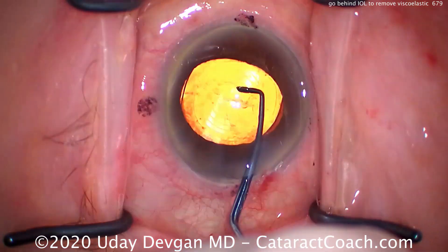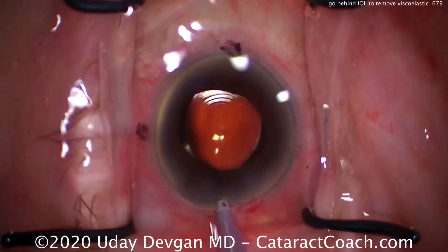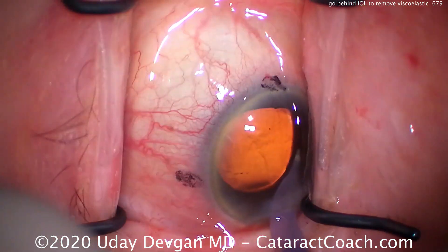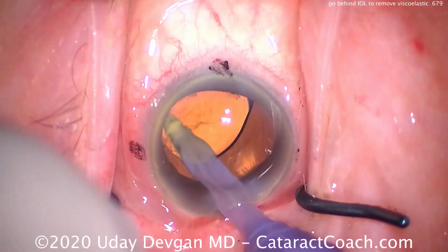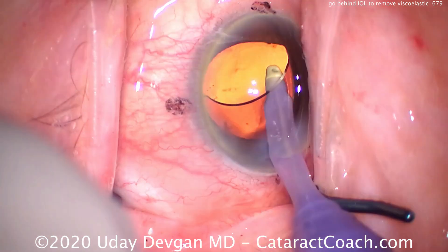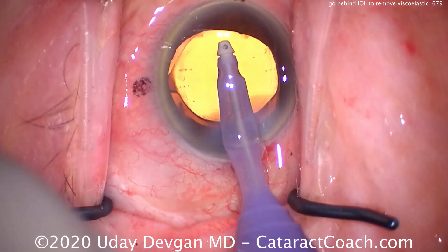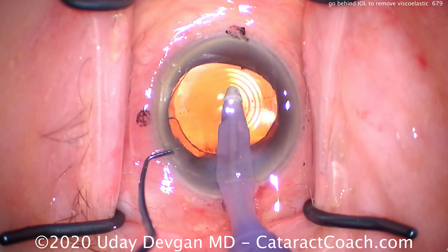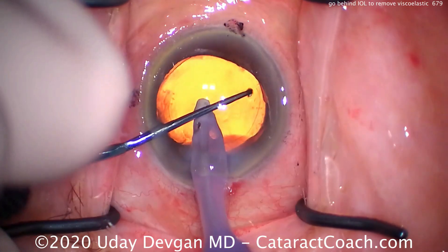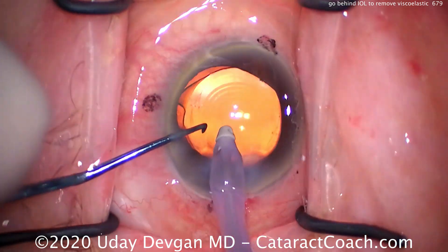Look at this case. You see the toric IOL marks at the haptic-optic junction — so this is certainly a toric lens. And now look, there are also diffractive rings. This is a trifocal toric IOL. This IOL has to be placed at a very specific axis, and we have to center these diffractive rings exactly correctly. This IOL optic is slightly tacky and will tend to stay where we put it — it'll stick to the capsule bag. But it'll only stick if there's no viscoelastic there. Viscoelastic behind the optic will allow it to slide and move around, causing the toric lens to shift to the wrong axis or the IOL optic rings to shift out of the center of the visual axis. So in that case, it's certainly very important.